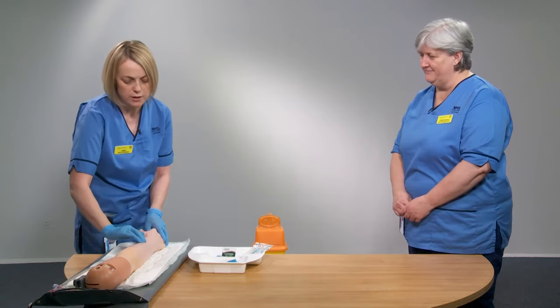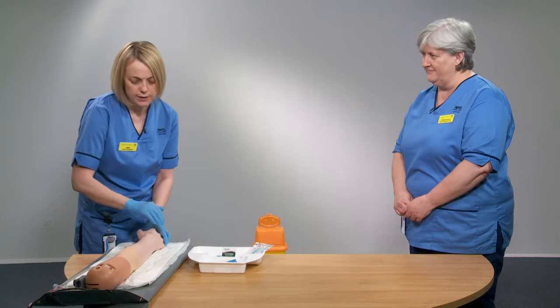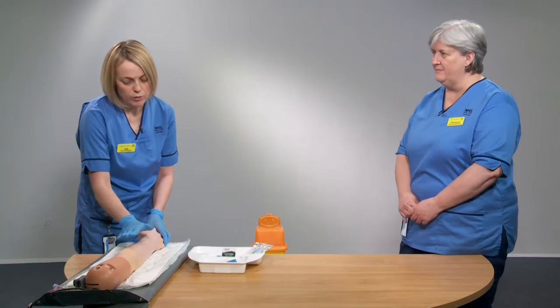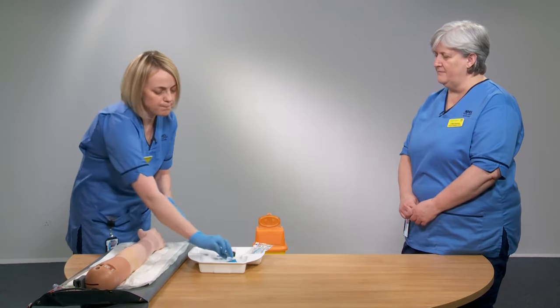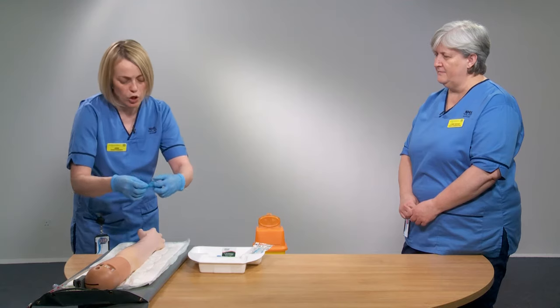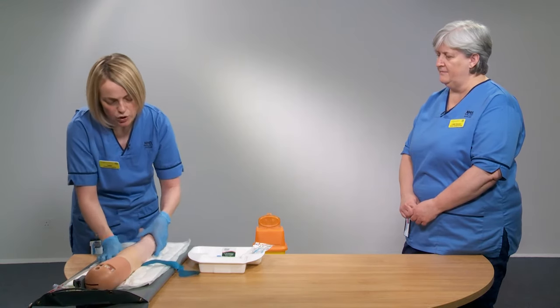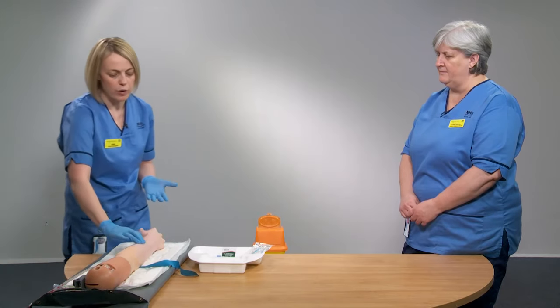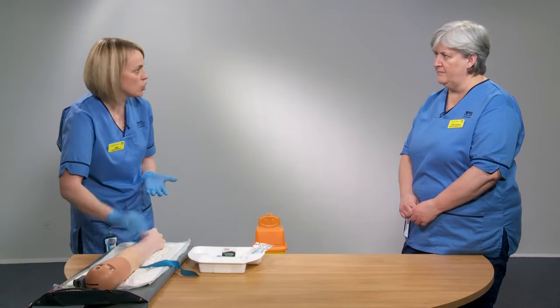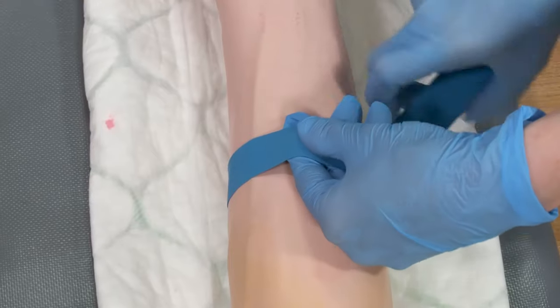Use two or three fingers to feel the patient's arm or hand. For venipuncture we tend to start in the antecubital fossa and upper arm area, feeling for a good vein. Once you've identified a suitable vein, apply the tourniquet approximately three finger-breadths above where your puncture site will be.